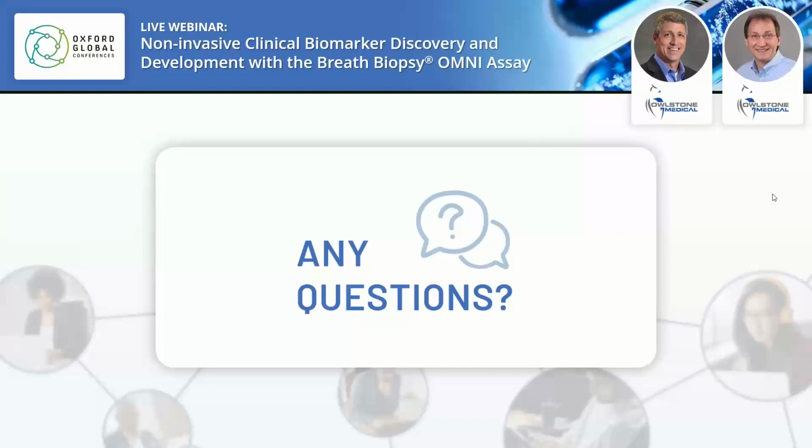You mentioned the additional value to VOCs and FeNO in asthma. Could the analyzer assess both from the same sample? VOCs and FeNO, is that what the question was? Yeah, that's right. Yes, you should be able to. Well, you wouldn't get it from our sample, but you could get it from the same patient collected at the same clinical visit.